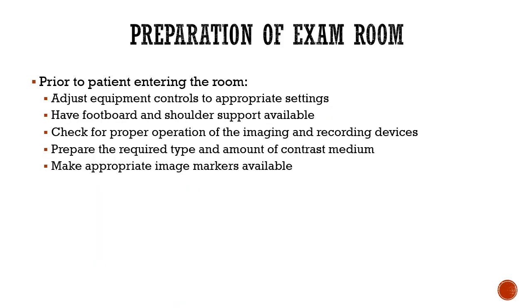Prior to the patient entering the room, we want to adjust the equipment controls to the appropriate settings. We want to have the footboard and shoulder support available. Check for proper operation of the imaging and the recording devices. Prepare the type and the amount of contrast media and make appropriate image markers available.